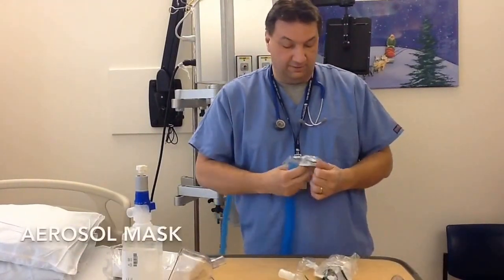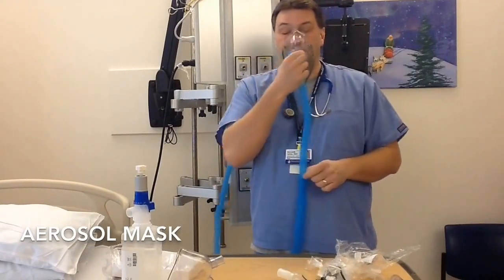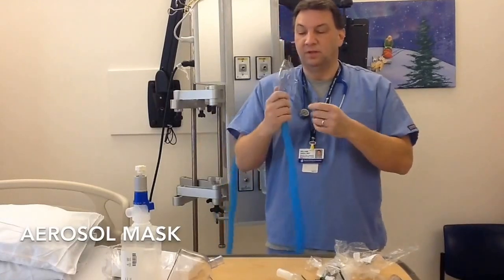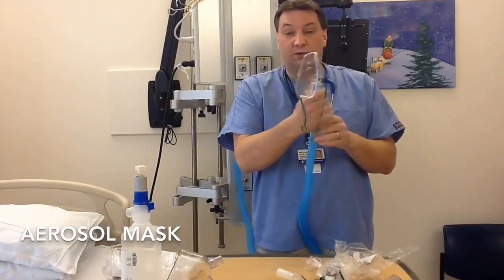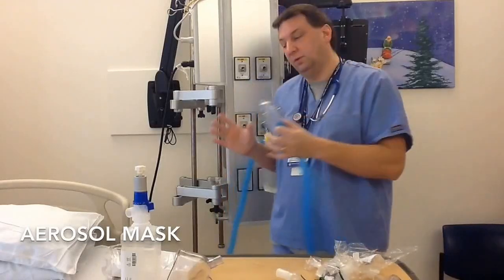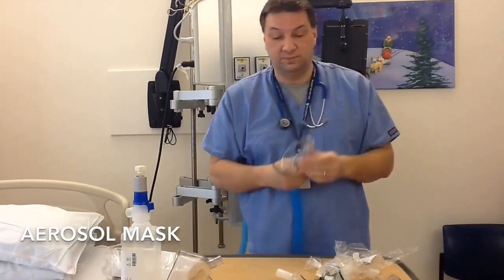Another device that we have, a couple devices here, are the actual aerosol masks, and these fit right on the nose and mouth of the patient. And again, we can adjust the FiO2 and the oxygen percentage and flow going to the patient. If the patient can tolerate it, this is a great way to deliver it, because now it's more confined and we're able to manage flow a little bit better and make better guesstimations of the oxygen being delivered to the patient, because there's not a lot of room air entrainment with this.